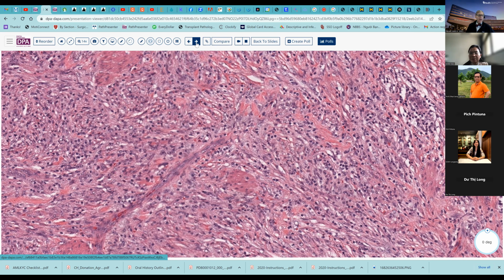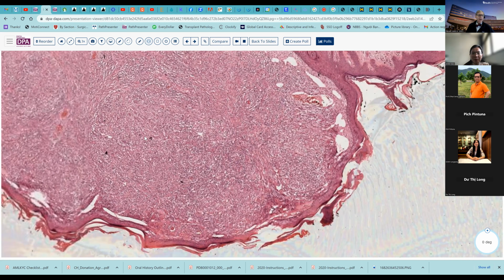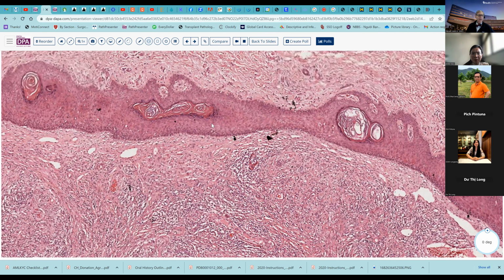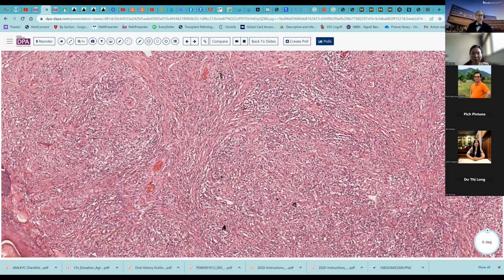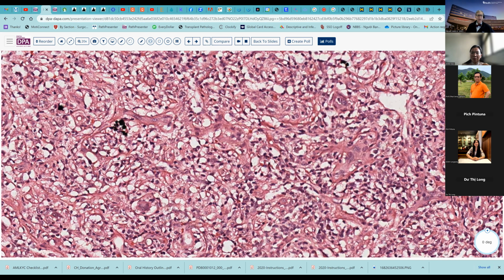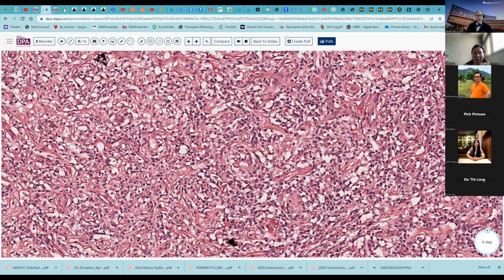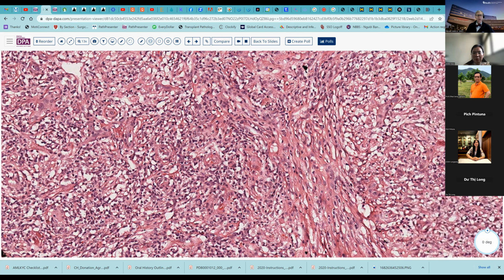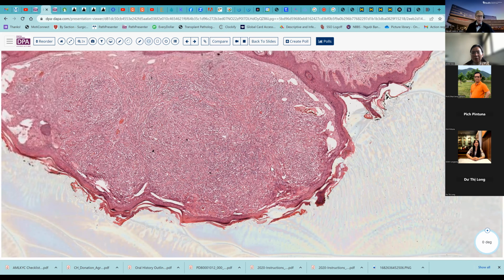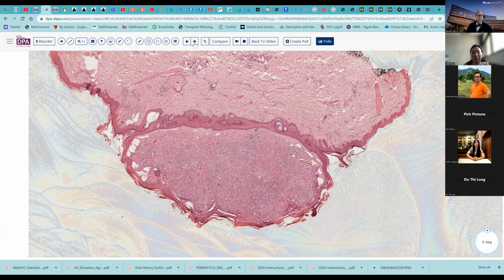All right. Well, this tumor can also occur in the skin. And here's a little example of that. Here with this little collarette around it, it almost looks like a skin primary tumor, but when we come into here, it's very much the same process, a mixture of inflammatory cells and fairly bland spindle-shaped cells, as you can see here. So we might mistake this for a capillary hemangioma that's become sclerosed or something of that sort. But in fact, this did have an ALK mutation.